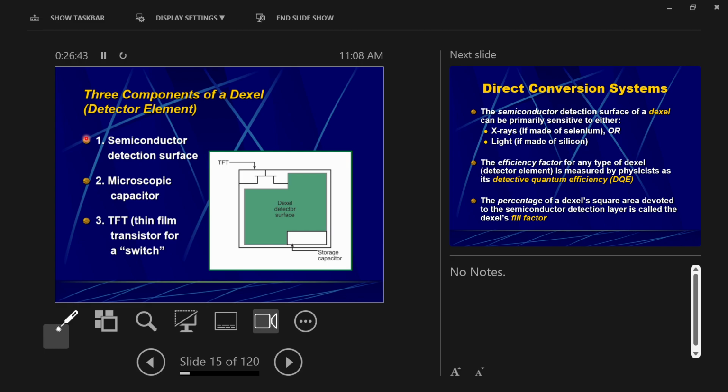What can X-rays do? They can pass through things, right? Think about what X-rays do to individual atoms, though. They can ionize the atoms. Have you guys heard the word ionize before? Sounds familiar, maybe wouldn't be able to tell me what it meant, and that's good, because you shouldn't be able to. X-ray techs should, though, once you learn this stuff. So what in the world is ionizing, and what does it have to do with X-rays?